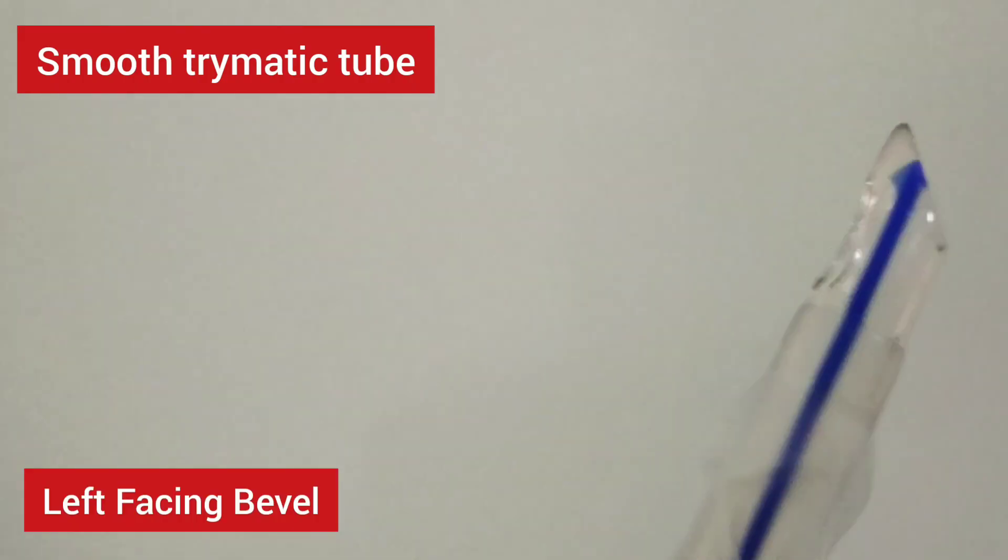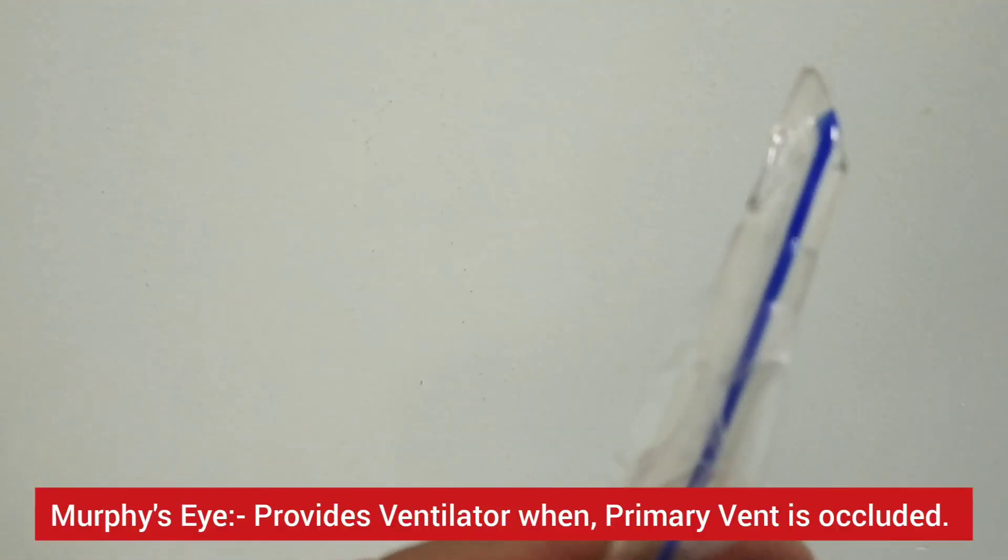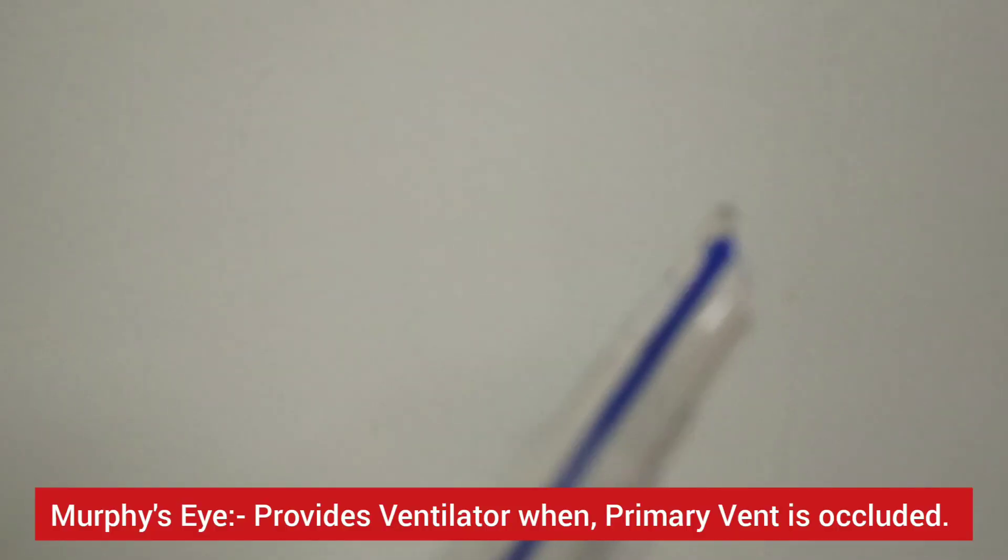These are smooth, atraumatic tubes and have left side facing bevels. Here we can see the left side bevel with the Murphy's eye. Murphy's eye provides ventilation in case the primary vent is occluded.